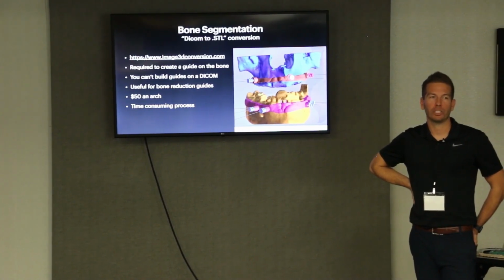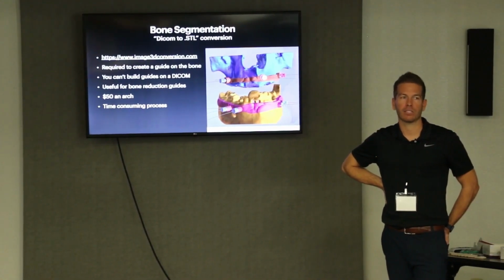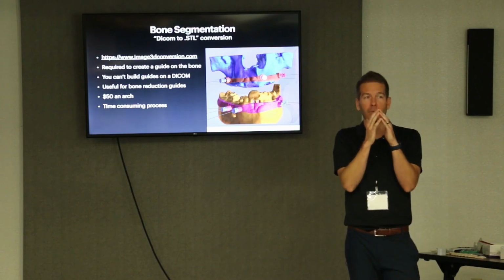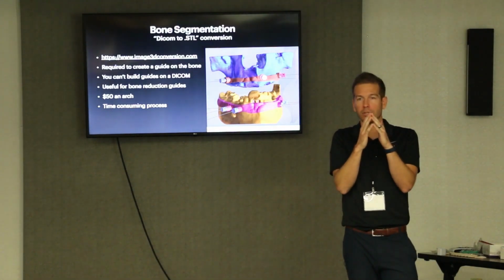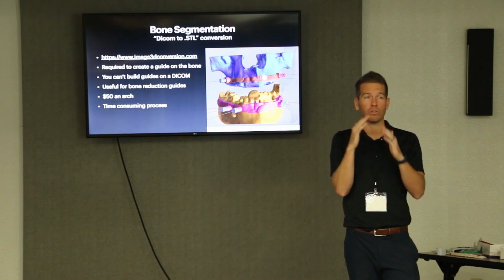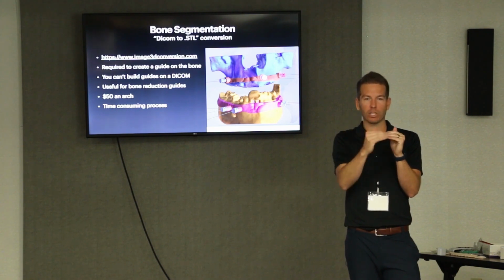So did you try to punch? Yeah, so that's exactly right. Those are very, very tough to do because usually you've got a knife edge or a very, very pointed ridge. That's the same with our single tooth. So don't try entering the ridge at a knife edge approach, whether it's a single tooth or a soft tissue guide. You've got to get that flattened into a solid platform.